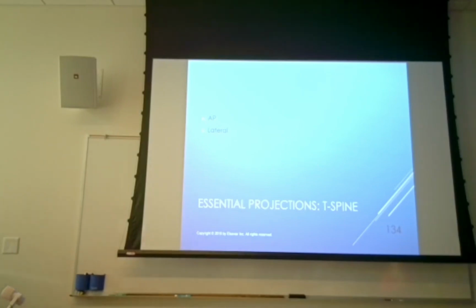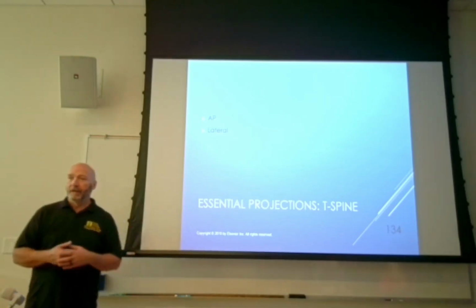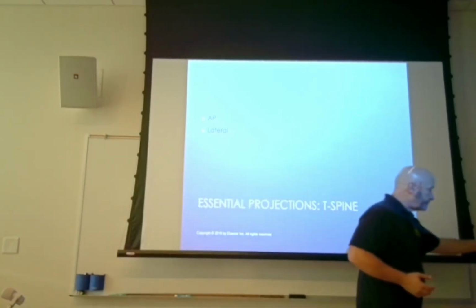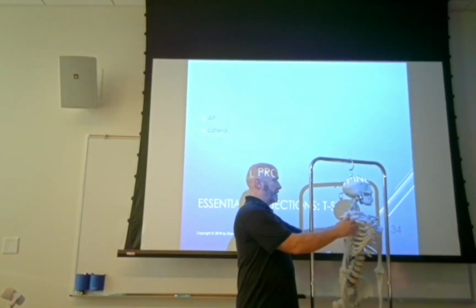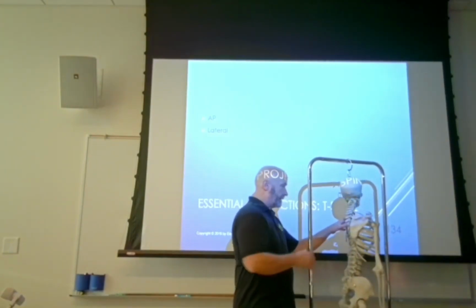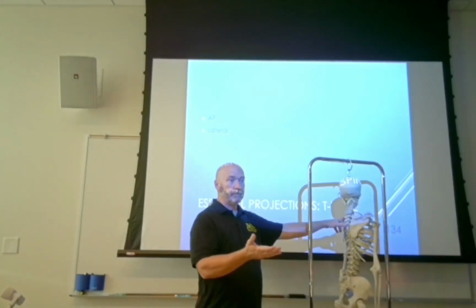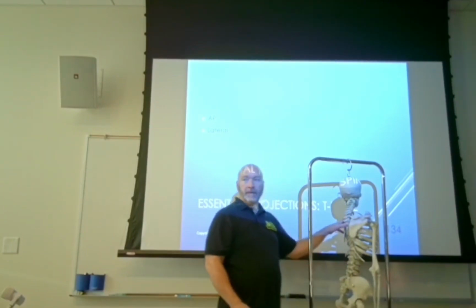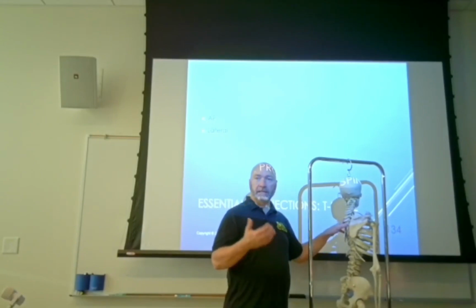Now, just like in the C-spine, the T-spine is never just going to be AP and lateral. And the reason for that is because the T-spine, much like the C-spine, what's going to be over the upper portion of the T-spine? Okay, ribs always. The sternum's going to be anterior, but how about the shoulders, shoulder blades, right? You shoot a lateral chest x-ray, and can you see C7-T1?